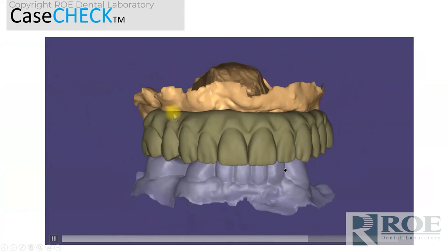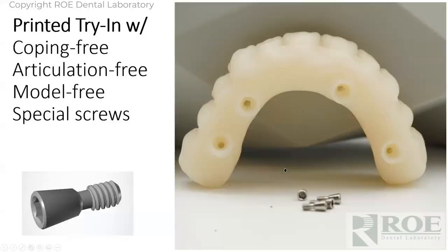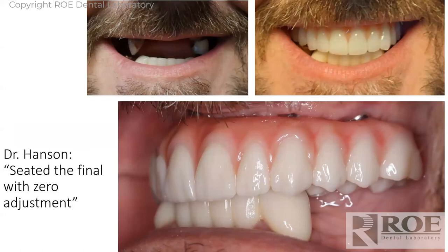We make a proposal — that's what we're proposing as the new final. We send that off to the doctor as a preview, sometimes just screenshots with the DTX Nobel software, sometimes a video plan. Doctor signs off on it. We fabricate a printed try-in for trial. These special screws contact the resin only — no copings. Now we're really test-driving the coping-free prosthetic. The printed try-in with pink went perfectly — no adjustment to the Procera bridge. He screwed this in with zero adjustment. He did not have to send the prosthetic back, there's no model, there's nothing to articulate or ship — he just calls us and says make a final.